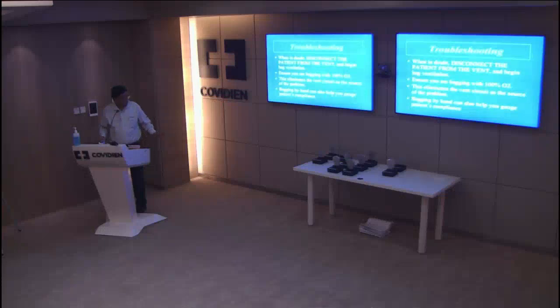The main thing, of course, again, is troubleshooting, which we'll talk to you about. The main thing initially in troubleshooting is to disconnect the ventilator and bag the patient. That's the first thing. Safety first: disconnect and bag. Because when you're bagging, you can also find out something about the compliance and resistance of the lung. First, that's the safest thing. Disconnect and bag, then start doing the troubleshooting.